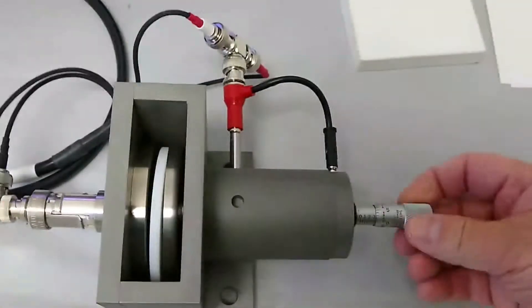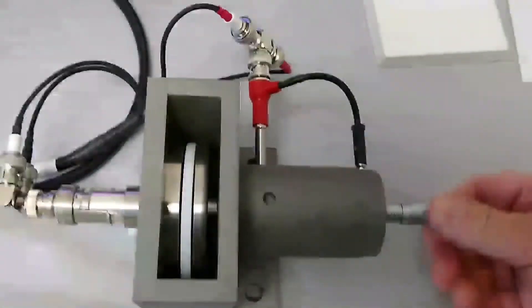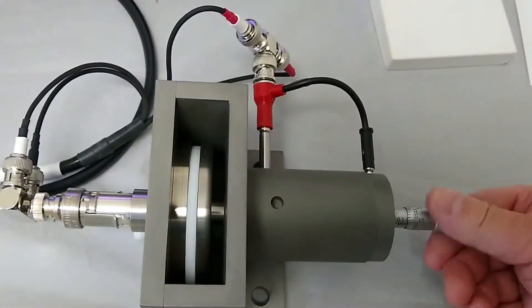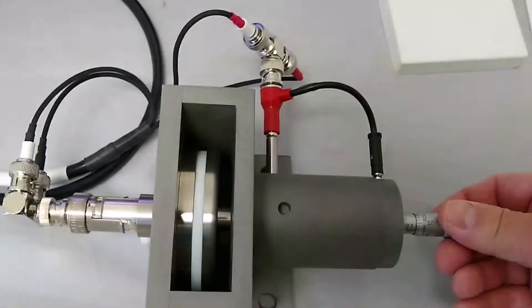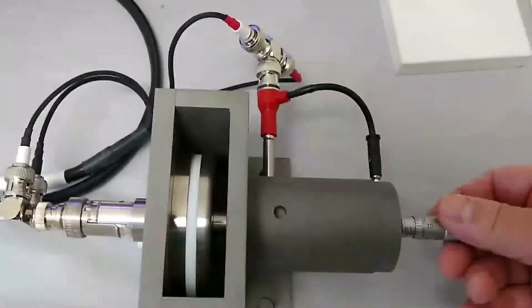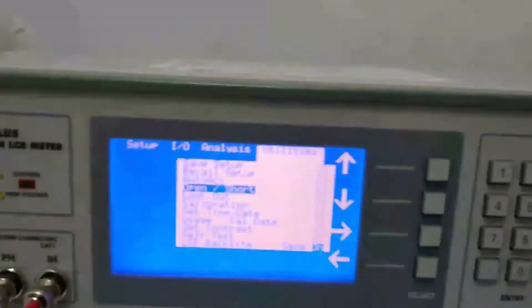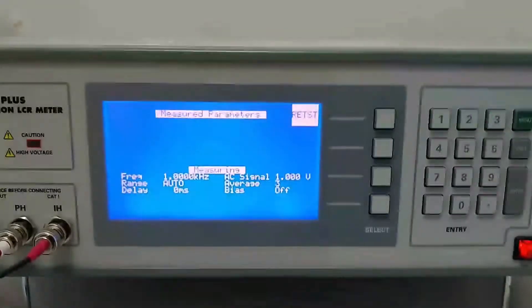With it in the sample holder, we can adjust the micrometer so the movable electrode sandwiches the Teflon standard in between. We don't want to apply too much pressure. Once we've done that, we can then press start and have the 7600 Plus perform a measurement.